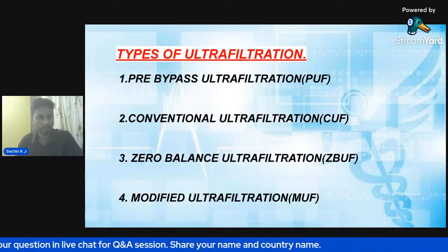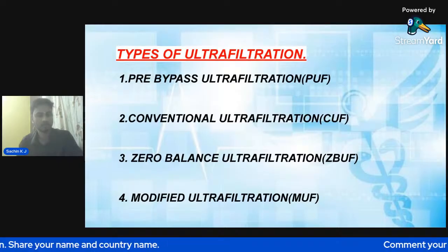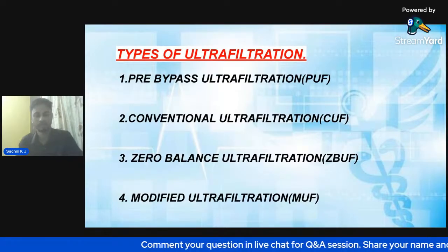Now I'm discussing types of ultrafiltration. There are four types of ultrafiltration: pre-bypass ultrafiltration, conventional ultrafiltration, zero balance ultrafiltration, and modified ultrafiltration.